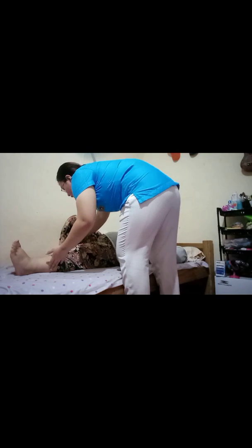So, ma'am, i-flex lang nato atong knee 45 degrees. Tapos, the unaffected one behind the leg for the support and to avoid over-rotation.